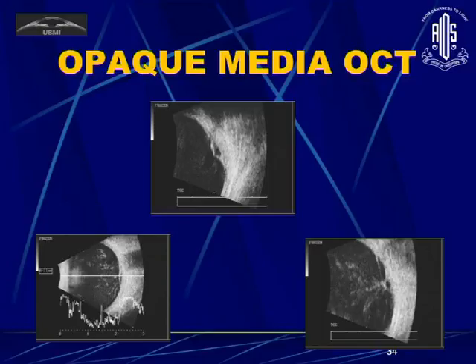What do you do when you have hemorrhages like this? If you want to see the macula and you want to give a prognosis to the patient prior to a vitrectomy surgery, your macular status is extremely important. So you have vitreous hemorrhage, and if you have elevated maculas like this or a traction on the macula, you can alert the vitreoretinal surgeon, or if you're doing an ultrasound yourself, you know that the macula is elevated, and probably you have to give a guarded prognosis to the patient.